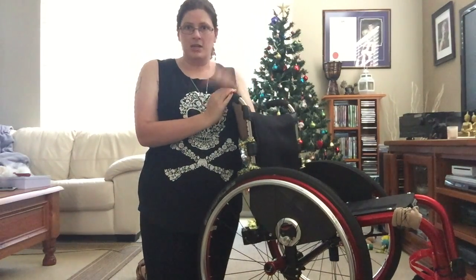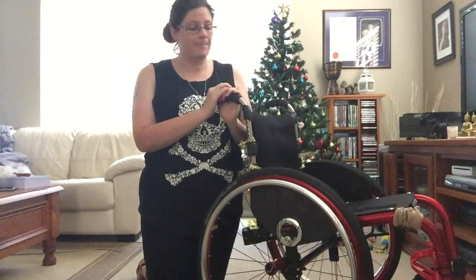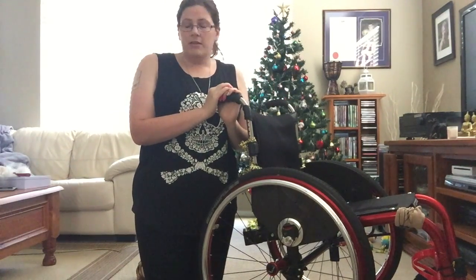Every time you get a new chair, you're going to have to get used to your centre of gravity, which affects how easy you can pop into a wheelie and hold a wheelie. So I think that's basically it.